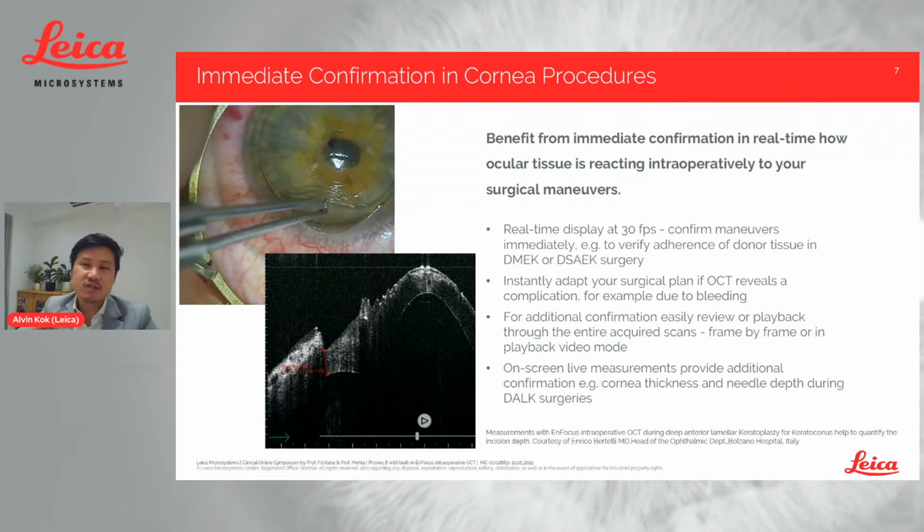You can also easily review, so in the bottom of the screen, you can review and play back the scans. And quite interestingly, there's a caliper function, and the caliper function allows you to measure the thickness of your graft and measure the thickness of your cut as well during the procedures.